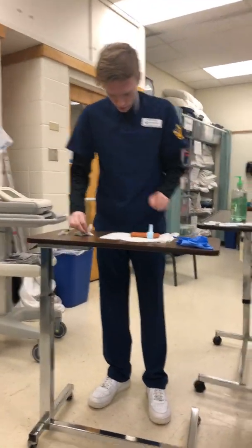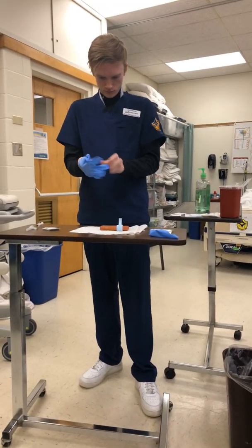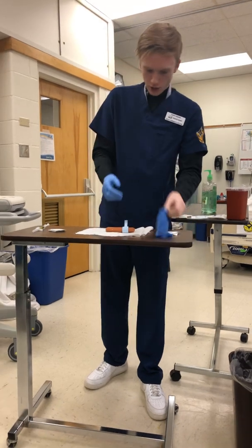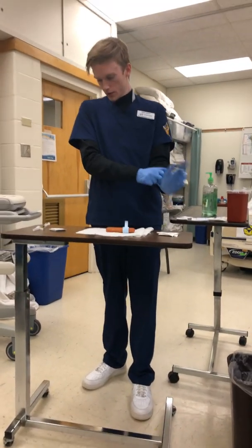And then I've identified my site and cleaned the site. Apply my gloves. And we've already done our third check before we administered by using 2 identifiers.